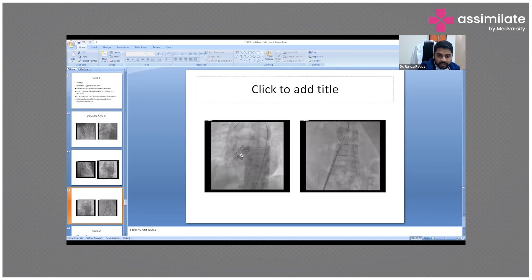This is how the valve looks — this is the frame. The bioprosthetic valve is inside but generally not seen fluoroscopically; only the frame is visible. This is after deployment — a balloon-expandable stent. On the right side, we remove the sheath and use special devices to close the artery to prevent any bleeding complications.